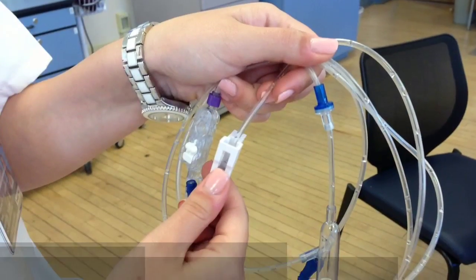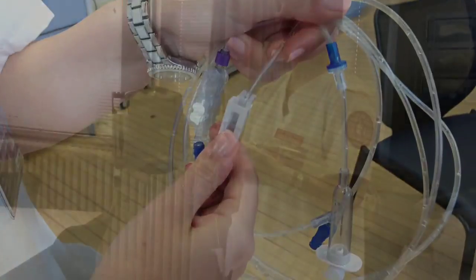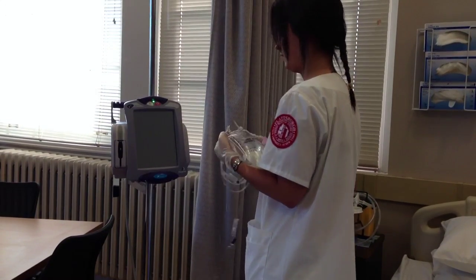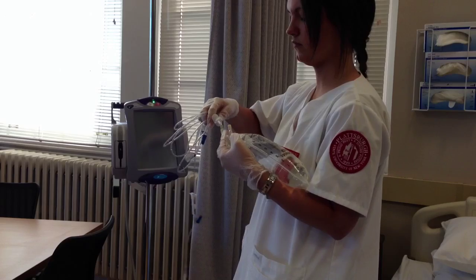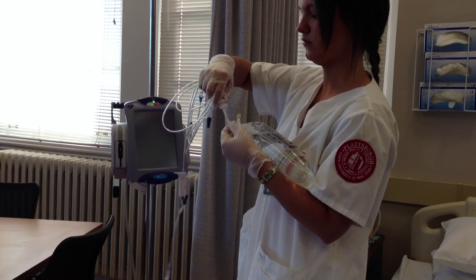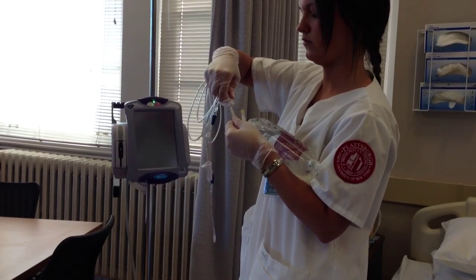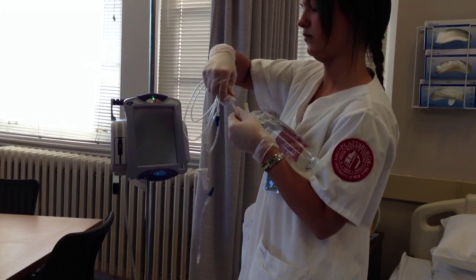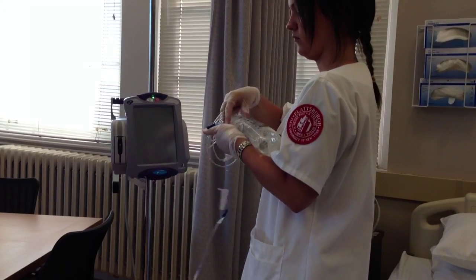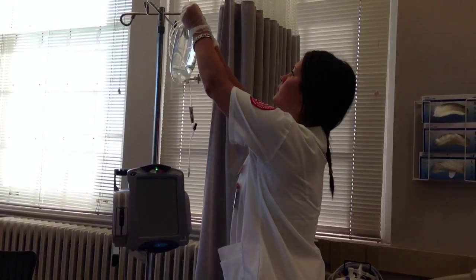Now you're ready to begin. Make sure your IV tubing is closed and clamped. The first thing you're going to want to do is remove the caps from both the spike on the IV tubing and the cap from the bag — make sure that you keep both of these sterile. Next, you're going to spike the bag. You can do this by hanging the bag up and spiking from underneath, or you can spike with the bag upside down — either way works just fine.